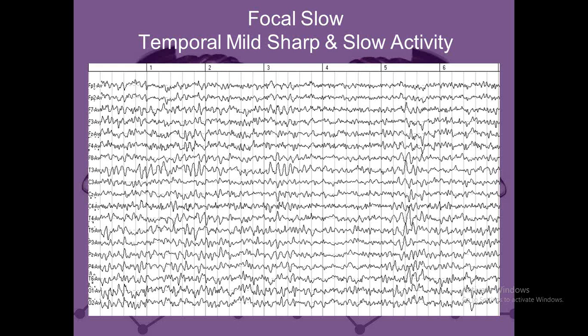This is one of the quotes that I've always remembered from him. I had one patient who was 50, he's my age, almost 65 now, and we identified this in him. This was like his third QEEG, and this popped up, and he happened to be a cardiac patient. We sent him back to his cardiologist, and sure enough, they had to put a pacemaker in, so his heart was not keeping up. It was kind of odd to have a psychiatric practice refer a patient back saying that his heart may not be doing well enough. Kind of a different twist.